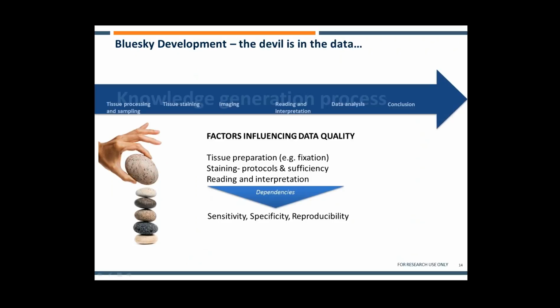Well, thank you very much, Hannah. So, as Hannah mentioned, tissue-based immunohistochemistry data is already used extensively in clinical trials, and in some indication areas as drug treatments, this type of input may increase further in importance, as we've already talked about. The only problem is that there is huge variability between centers in staining protocols, staining quality, and even in the reading and interpretation of biomarker data. And all of these can have a great impact on both precision and accuracy of data.